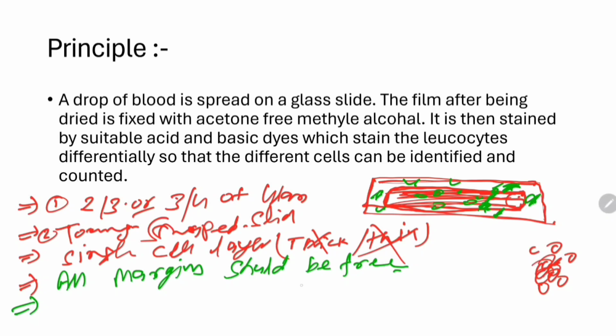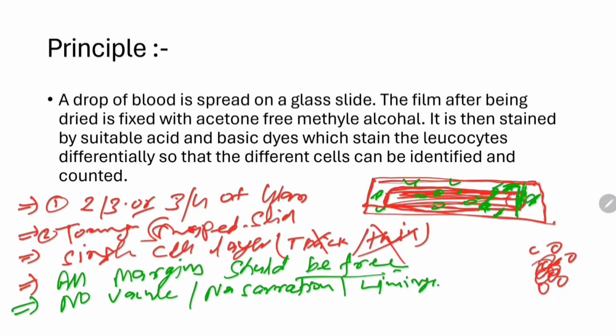So the margin should be free and there should be no vacuole or serration or linings. During the preparation of the blood film, you should prepare the blood film in one go.